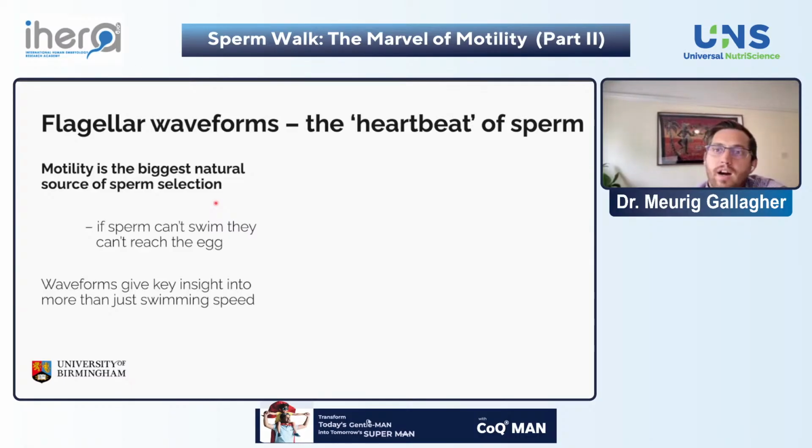So starting with that idea, thinking about movement, thinking about motility, you then need to think, well, what's causing motility? A lot of systems that talk about motility, whether that's manual analysis by WHO or CASA analysis by computers, really think about sperm head motion as being what motility is. But the head isn't moving. The head is being propelled by this tail that's responding to the environment.